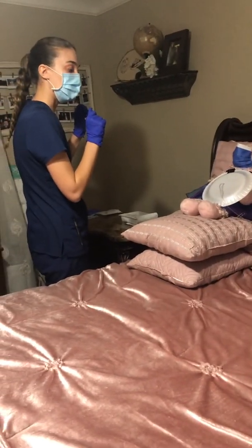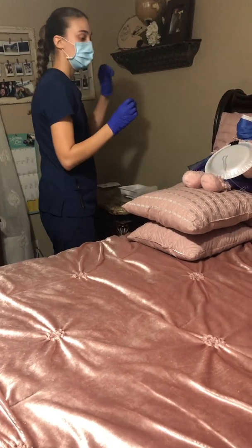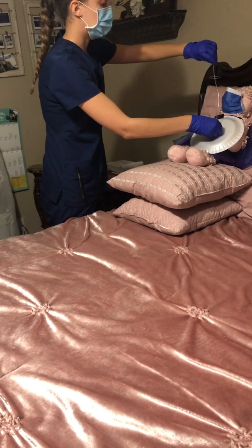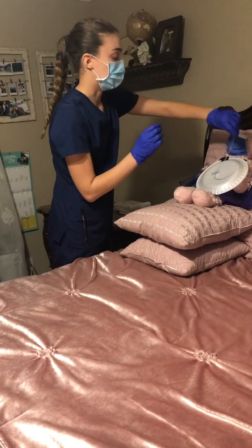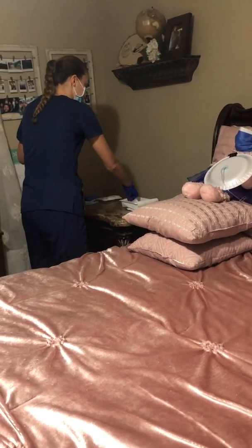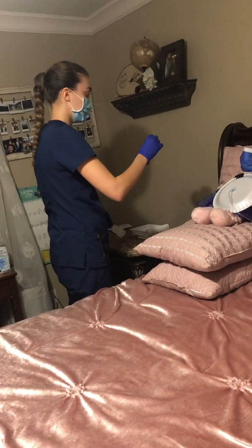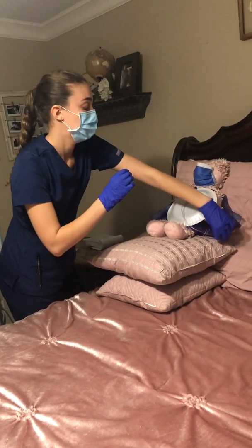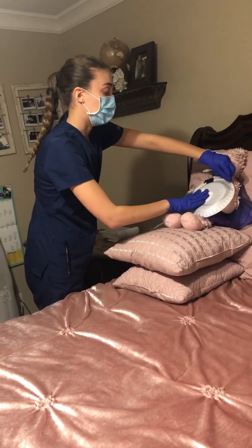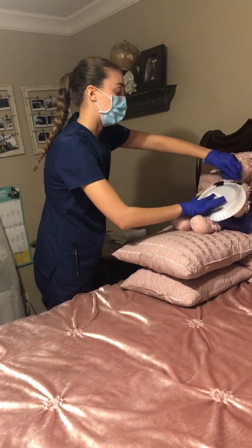Alright, and once it's all dry, I'm going to go ahead and use my sterile hand to grab my bio patch. Use my left hand to grab the tubing. Still doing okay, Mrs. Jones? No pain? Okay, we're almost done. Okay. Use my right hand to grab the Tegaderm. Go ahead and place this on, making sure that there are no air bubbles, anywhere where there can be a leak or air can come in or out.